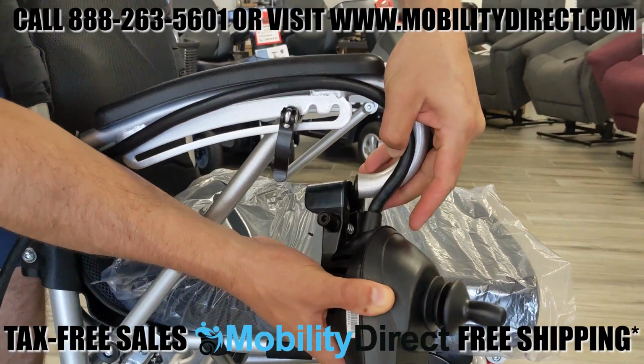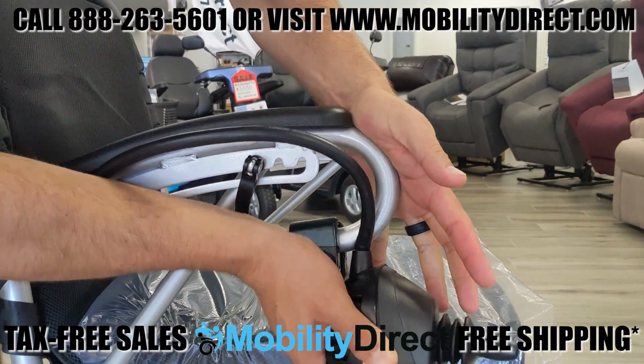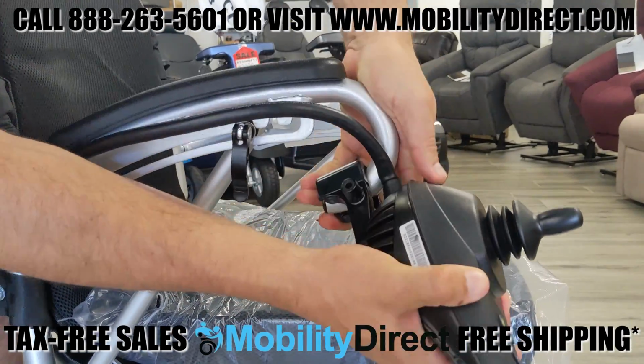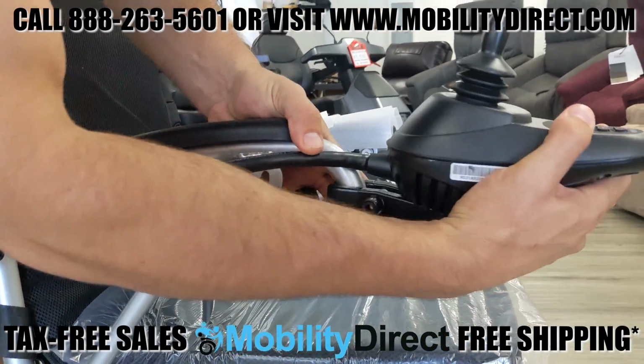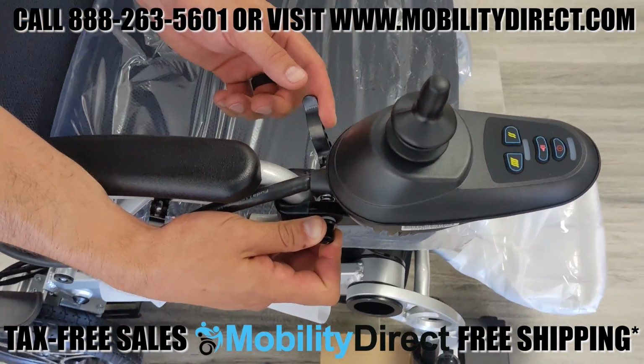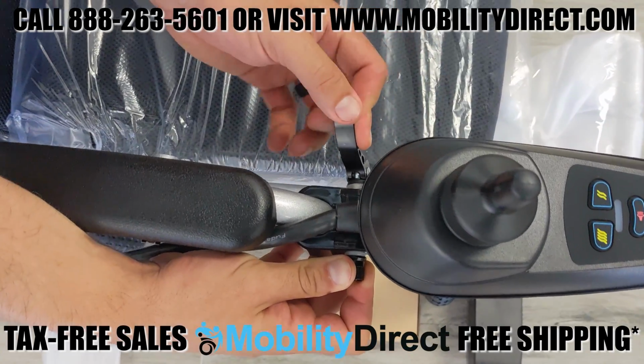The joystick controller clamp is just going to slide around that round piece that curves down. It does take a little bit of shimmying and a little bit of strength to wiggle it up and into place, but once it's there, it's pretty simple. It's just like a bicycle style seat clamp. You want to go ahead and tighten that clamp by twisting it counterclockwise.